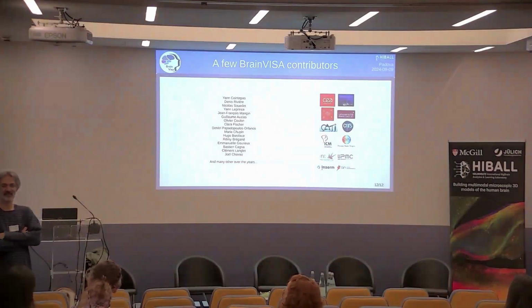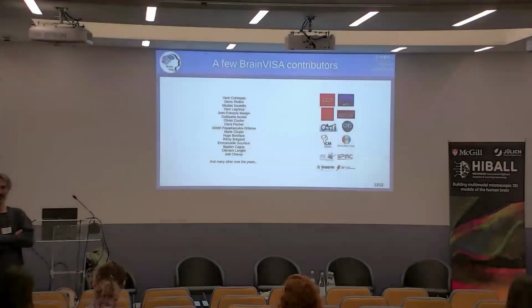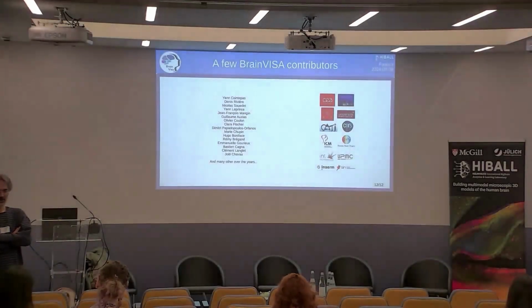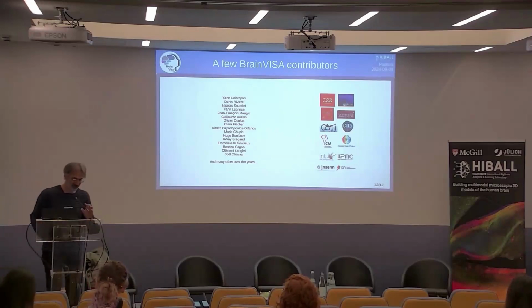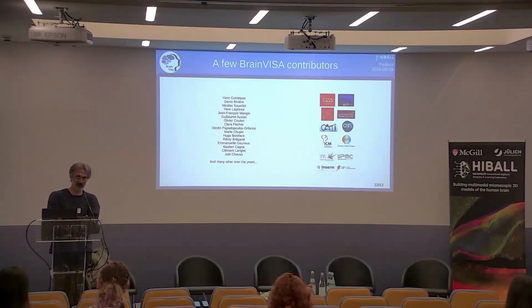Does it accept high resolution input, like less than 1 millimeter? And does it preserve high resolution input? The processing was actually designed for images of about 1 millimeter resolution. Yes, you're right. So the processing has been designed for images of about 1 millimeter resolution, actually.